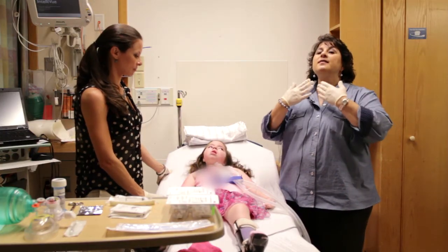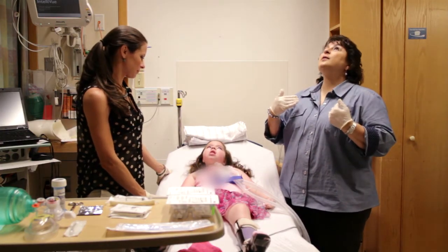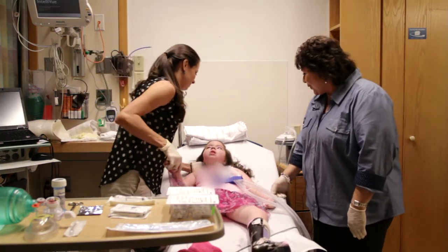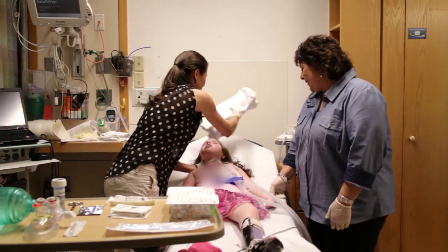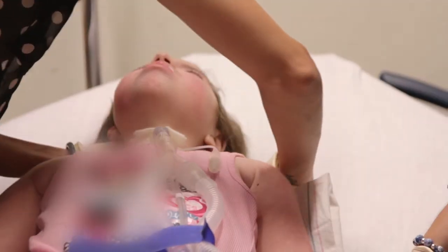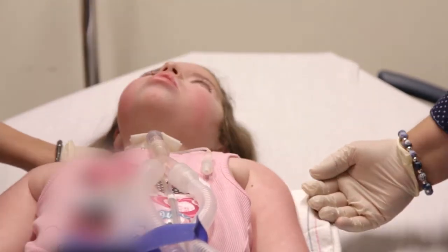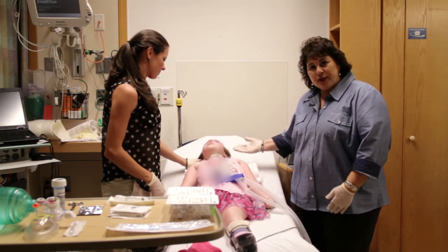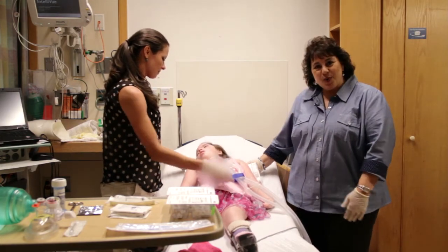April's going to put rolls underneath Drew's head. We talked about the rolls so that we can see the neck. We don't want to hyperextend, but we do want to expose her neck. So April's, her mom, going to put rolls under your neck? Yeah. So they're really under her shoulders, raising the back of her neck so that her head is pretty much still midline, but her neck is exposed.